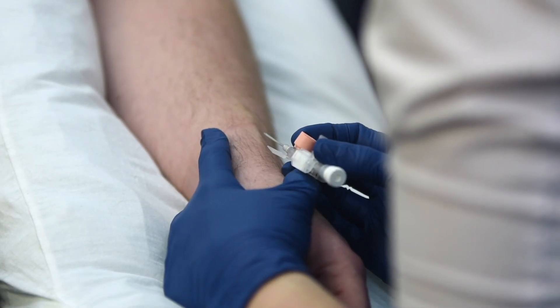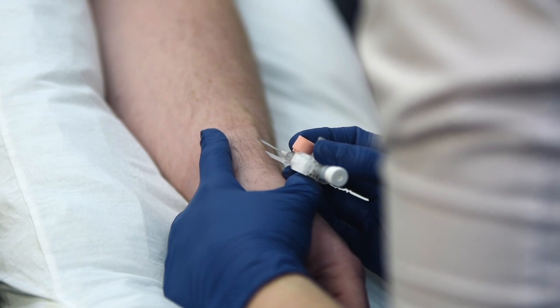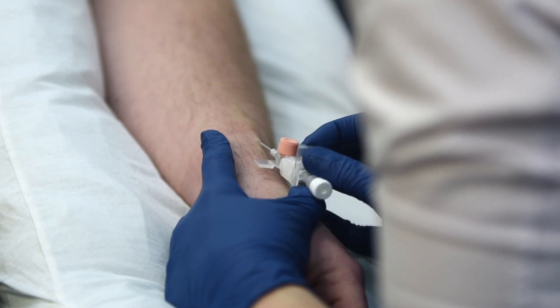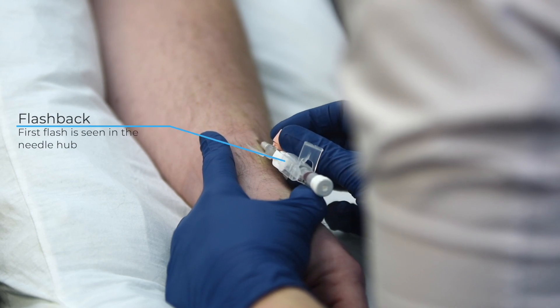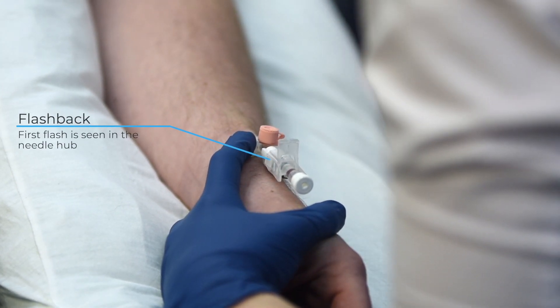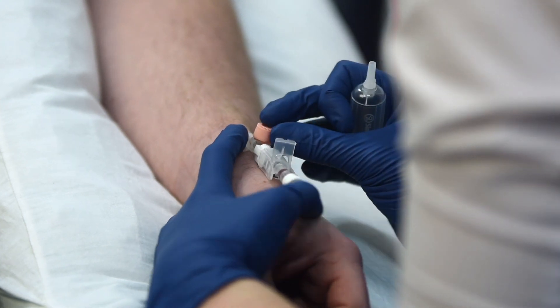Insert your cannula at an appropriate angle. If the vein is quite superficial and close to the surface of the skin then you might want to use a much more shallow angle. If you're going for a deeper vein or you're using an ultrasound the angle will need to be much more steep. Look for flashback in the chamber and try to advance the plastic tube off the end of the stylet. Push the tube in all the way up to the top - you don't want any of it sticking out of the skin - and remove the stylet.